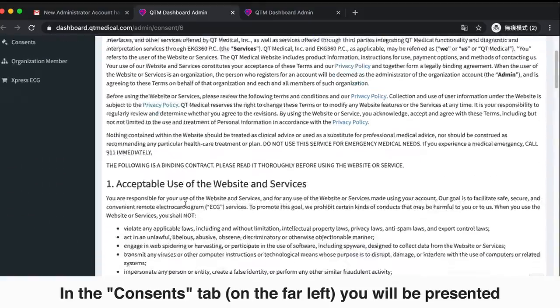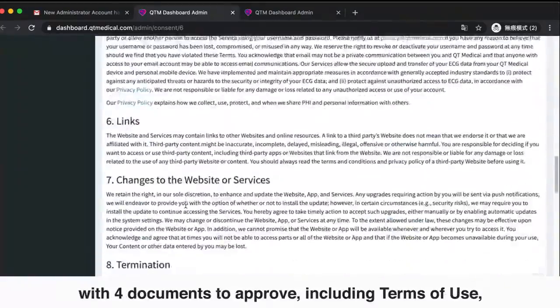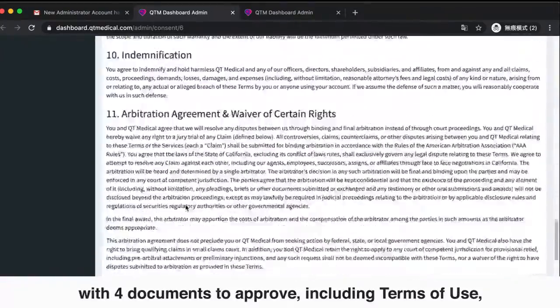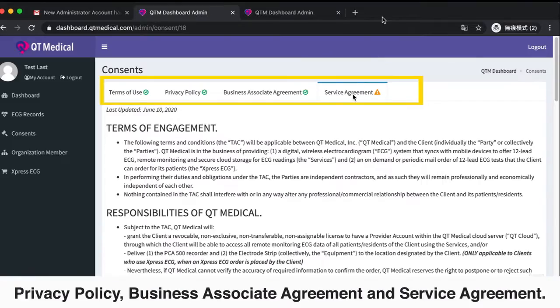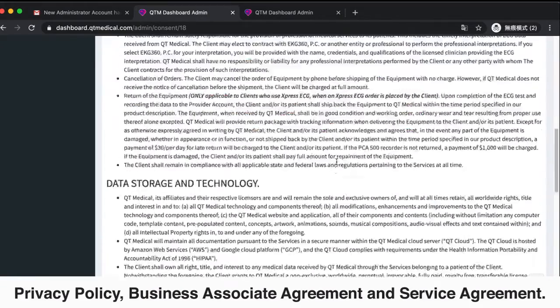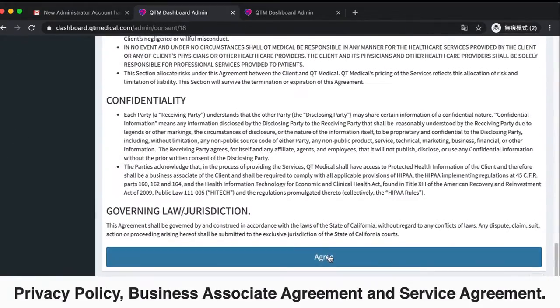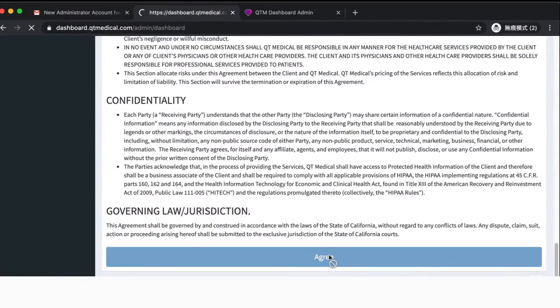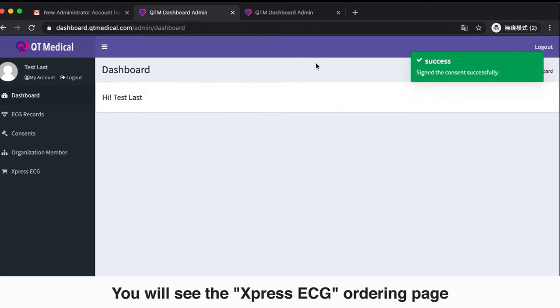In the Consents tab on the far left, you will be presented with four documents to approve, including Terms of Use, Privacy Policy, Business Associate Agreement, and Service Agreement. Please scroll through and tap Agree at the bottom of each page.